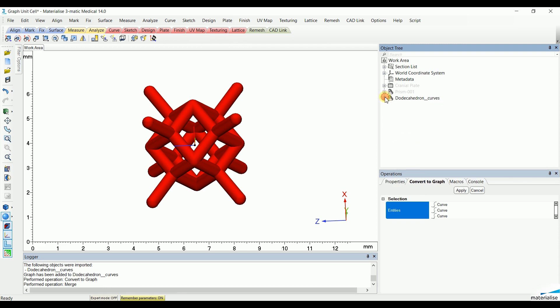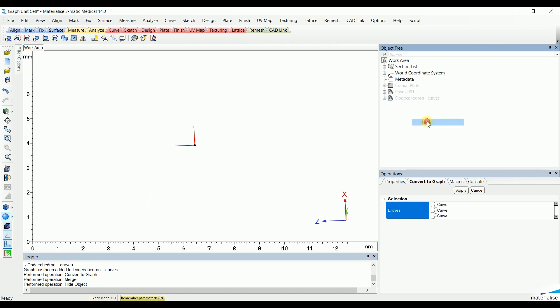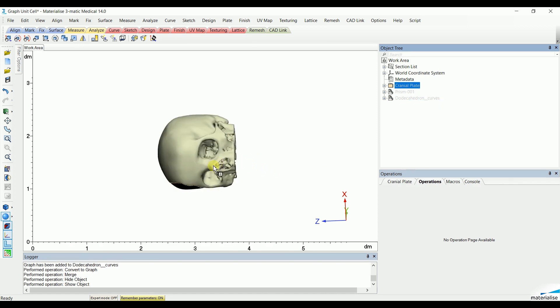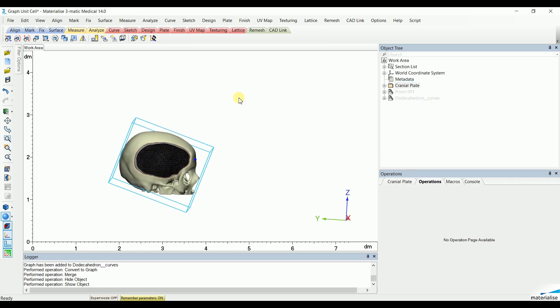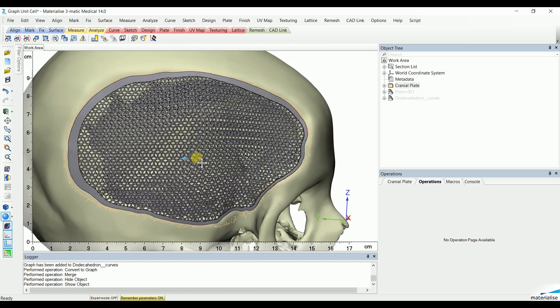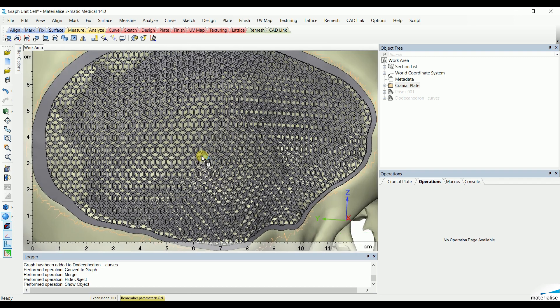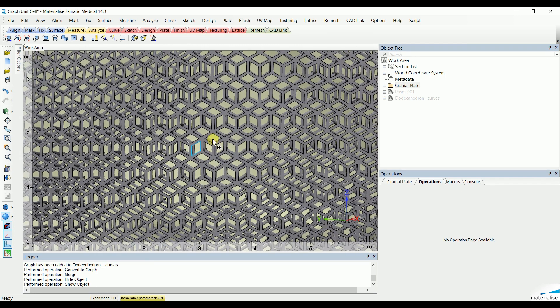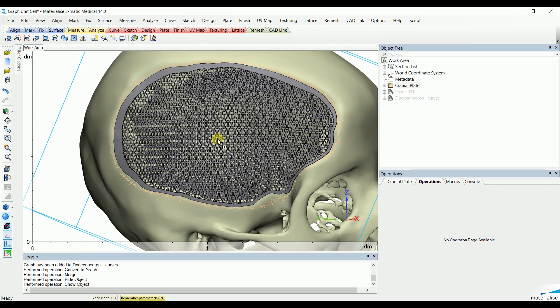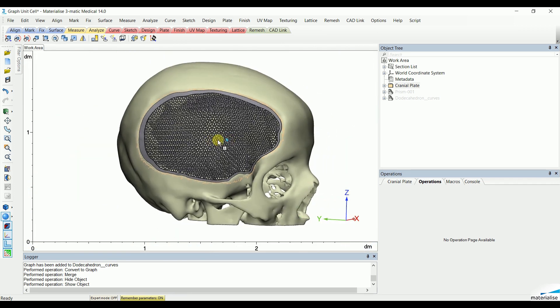These were the two different types of how you can create and adjust your own graph unit cell. And these can be used in the different range of medical applications. For example, a cranial plate with a porous structure. This one specifically has used the Honeycomb structure we just created in this video. Thank you for your attention. And this is the video on how to create your own graph unit cells.